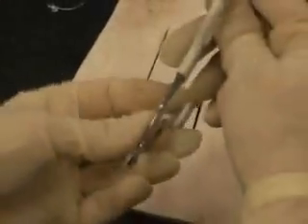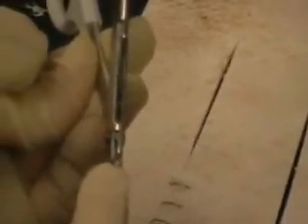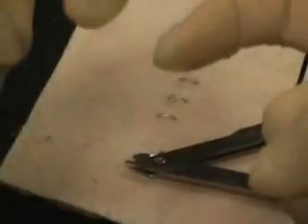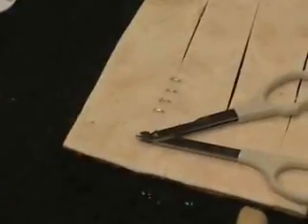Then once you go to take these staples out, there are a number of different little devices that are utilized, and again you may be able to see there's sort of like 2 teeth and 1 tooth. Usually the 2 teeth go down underneath, and the idea behind these staples is they go in and they bend. So the first time you push on that little instrument, it straightens them out, and then you can pull back and they come straight out.